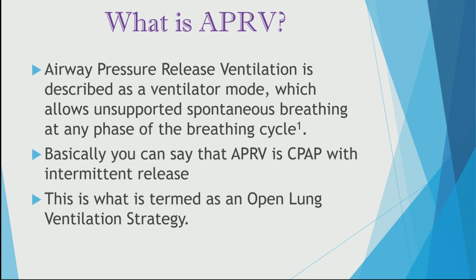How it was once instructed to me is that APRV is CPAP with intermittent release followed by reinflation, so that the patient is able to breathe at the top end, the high pressure, and at the lower end, the low pressure, with their own spontaneous tidal volumes and breaths.